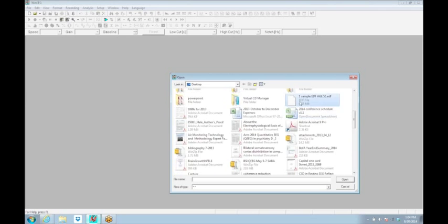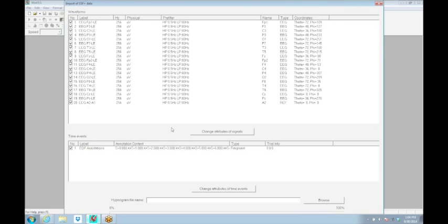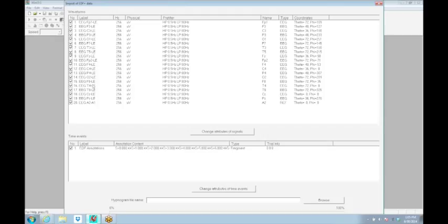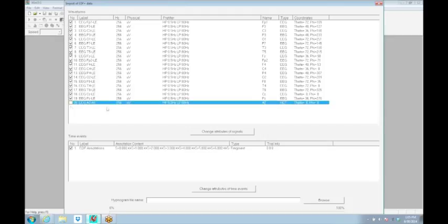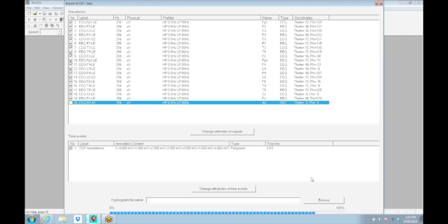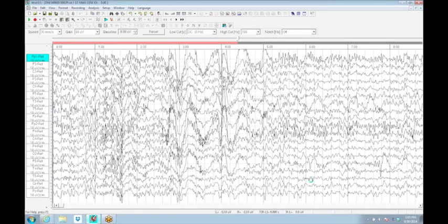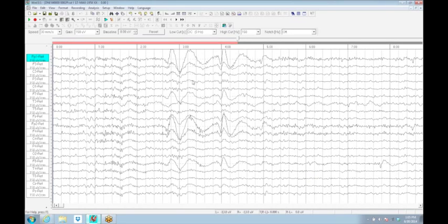Let me pull an EDF Plus file in. The EDF Plus file lists all of the electrodes, and sometimes you'll get an FPZ or OZ or extra electrode set that aren't on a normal set of maps. Everything is linked ears, but A1, A2 we can turn off because that's a channel that wouldn't be analyzable under a linked ear montage. I hit enter and it imports all of that data.